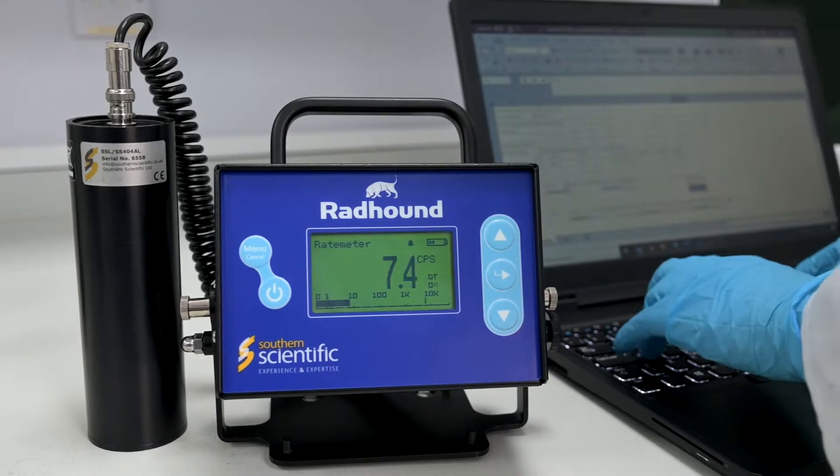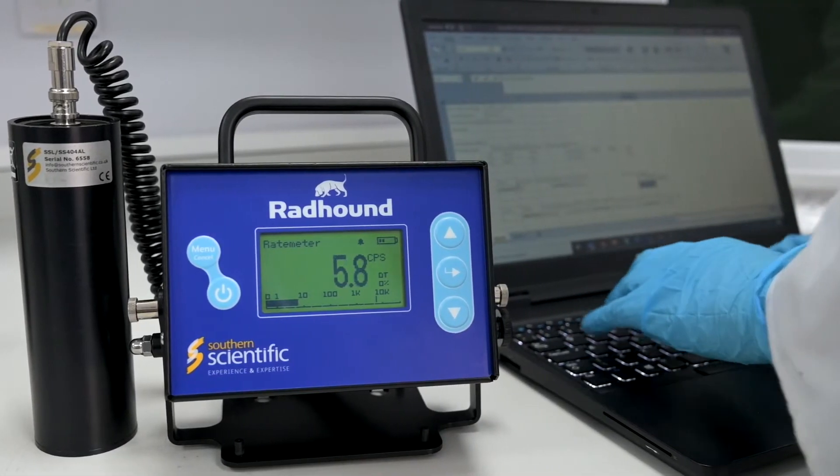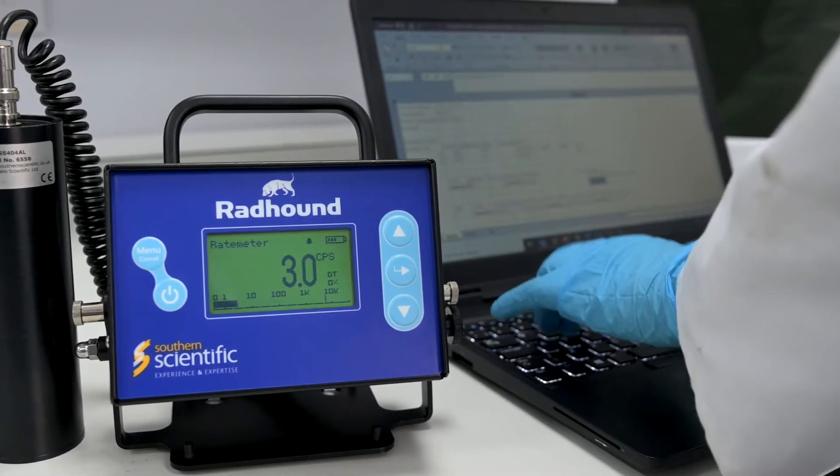Beyond this, modifications for your instrument are also readily available. An RS232 connection can be established to stream real-time count rate data to a remote desktop. Or a beacon alarm can be installed. This provides you with a visual indication of when an alarm threshold is exceeded.